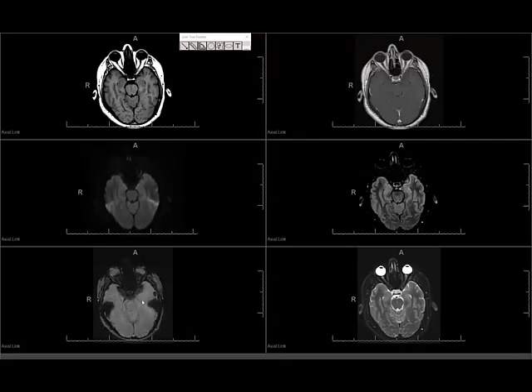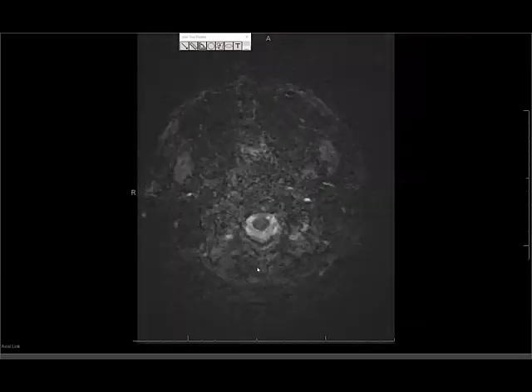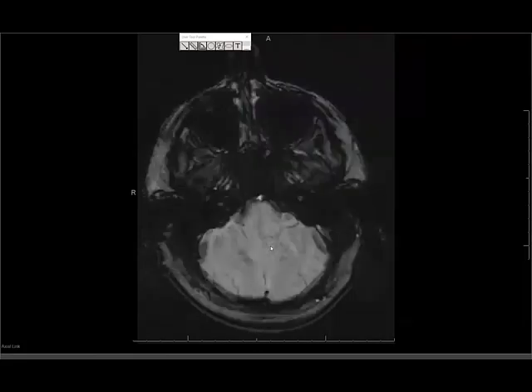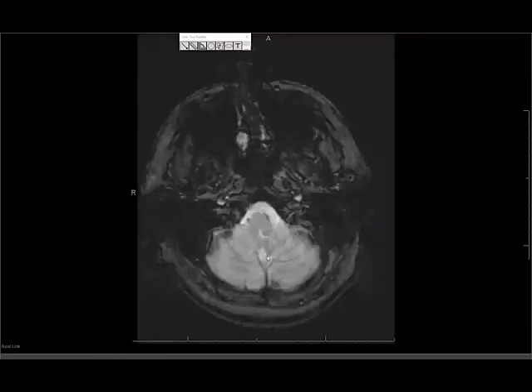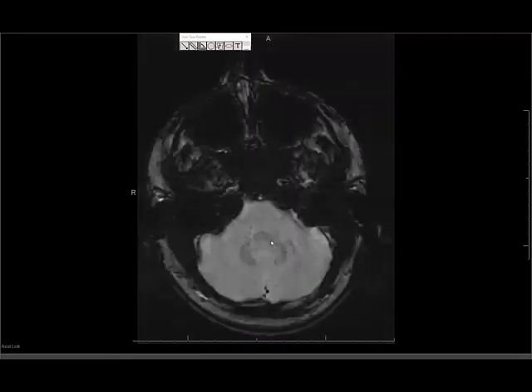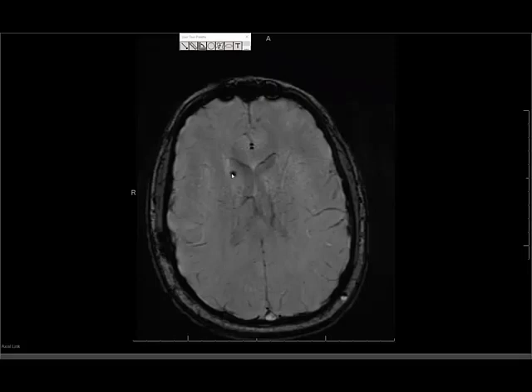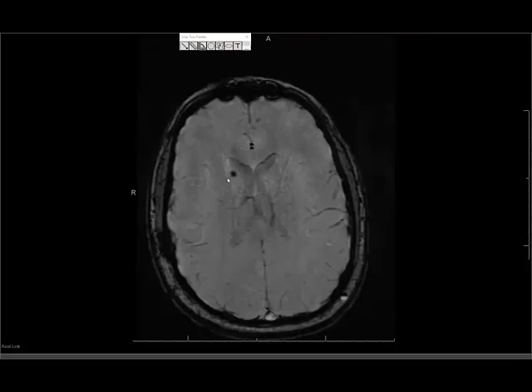After these two sequences, I look at the SWI sequence, which is a susceptibility-weighted sequence. Some places use a GRE or gradient echo sequence, which is similar — basically looking for blood products. It can also help evaluate for calcifications. This is a sequence you can scroll through slightly faster, because you're primarily looking for something dark. In this case, there is clearly something dark — there is susceptibility noted in the region of the right caudate nucleus, which ended up being a calcification on CT. There is clearly a focus of abnormal signal on the SWI sequence in the right caudate nucleus.